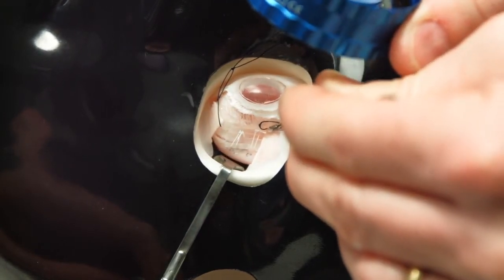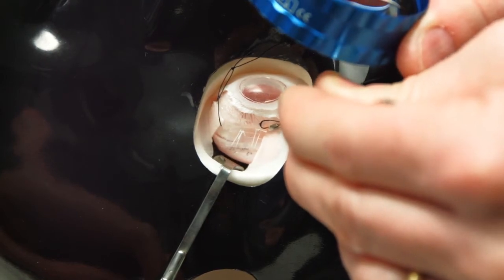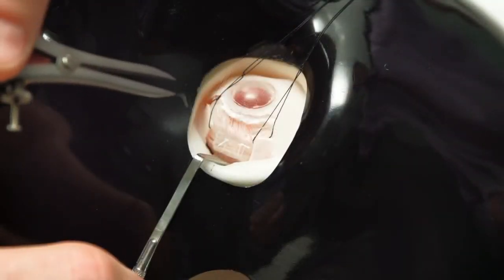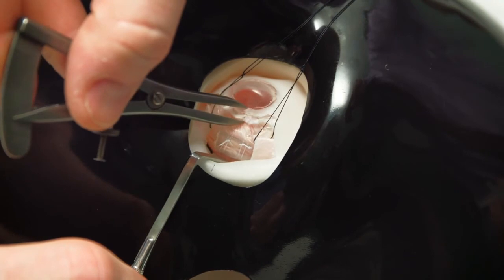As the subretinal fluid is draining away it can be observed with an indirect ophthalmoscope, and it's ideal to continue pressing for three to four minutes in order to prevent further bleeding or any bleeding occurring in the choroid.